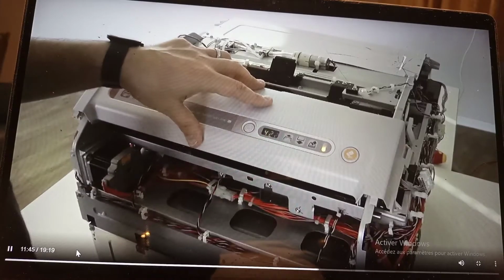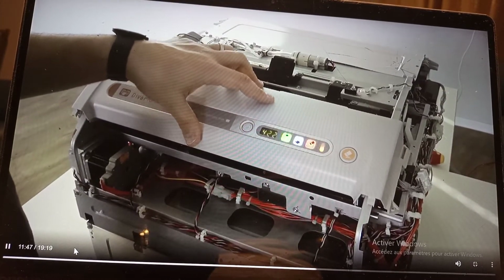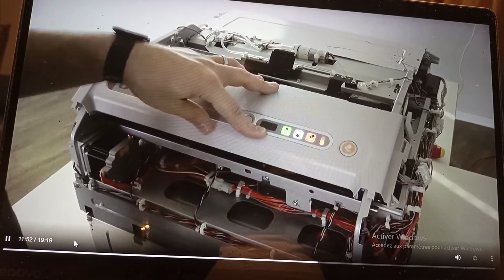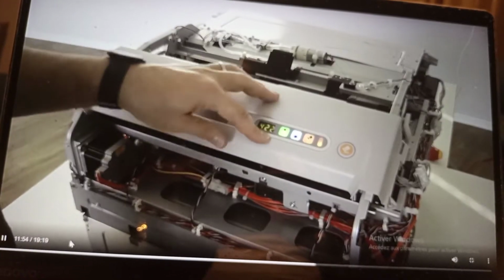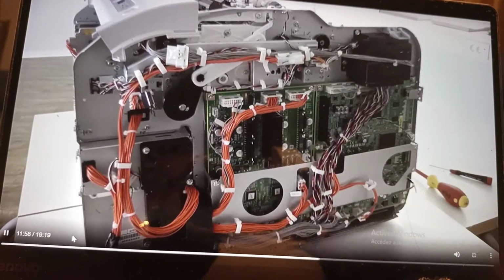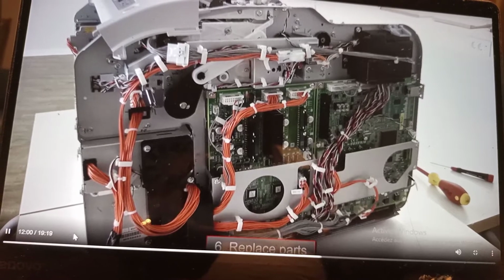So after that we can go on to read out the status of all sensors to check if the sensors are working fine. In the next part I just want to show how to change some parts.